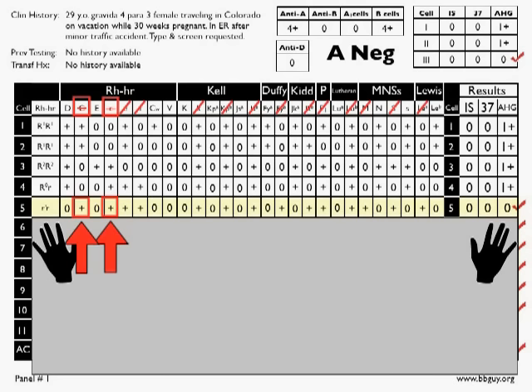I prefer to keep every diagonal slash I put on a panel as a double dose rule out. So with one exception, and we'll show you that in a minute with big K. So I don't do what I just described to you. So I would not do a rule out for either big C or little c on cell 5. And then we move on to big D, which is obviously not present and has no reaction.